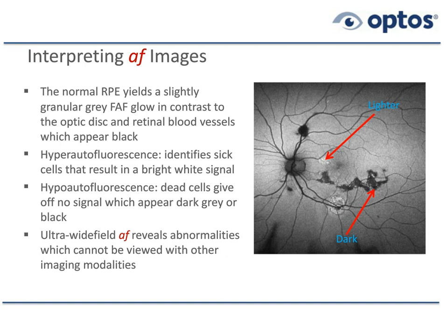And ultra-wide field autofluorescence reveals abnormalities which can't be viewed with other imaging modalities. Think about it for a second. You can dilate a patient to 8 millimeters, use a binocular indirect ophthalmoscope, and you may be very good with it, but you're not going to see abnormalities at the level of the autofluorescence that we can see with, let's say, a Daytona system. A lot of these findings are invisible even to indirect ophthalmoscopy through a dilated pupil.